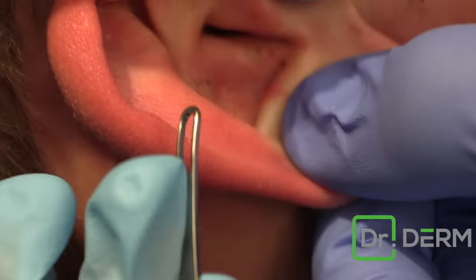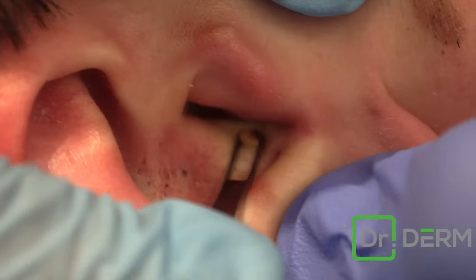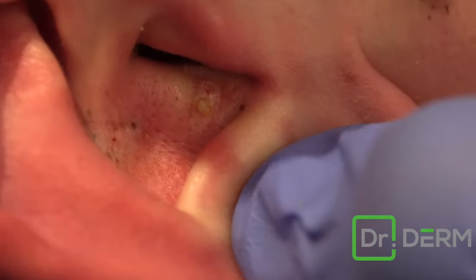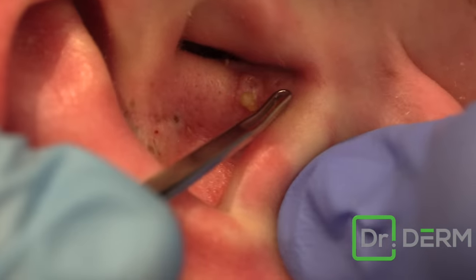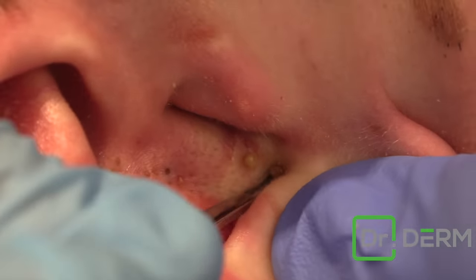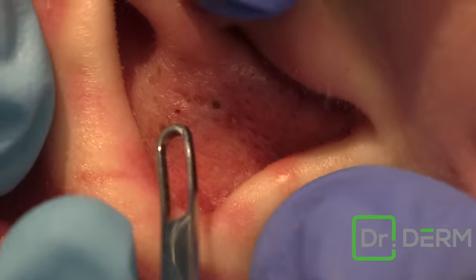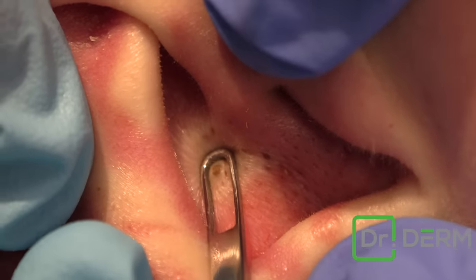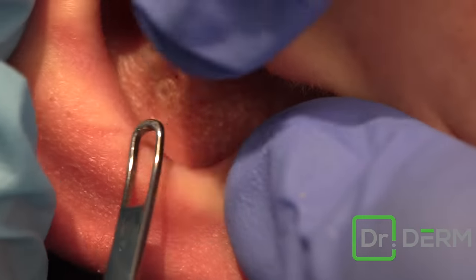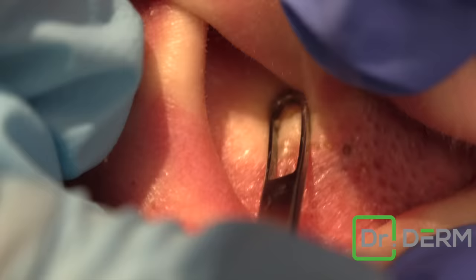We numbed these up and this one should come out real good. There's that one. These crease ones are not fun. Let's get those out. Perfect, go for it. How you doing? You can't feel those ones, right? No, I can't feel the ones down there. Hallelujah. Because the ear ones are not fun.